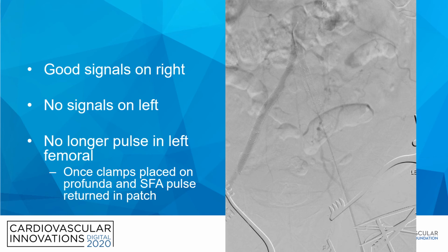At that point, we had considered using IVUS, but knew that we were going to now just stent this anyhow. The angiogram here shows no good filling.